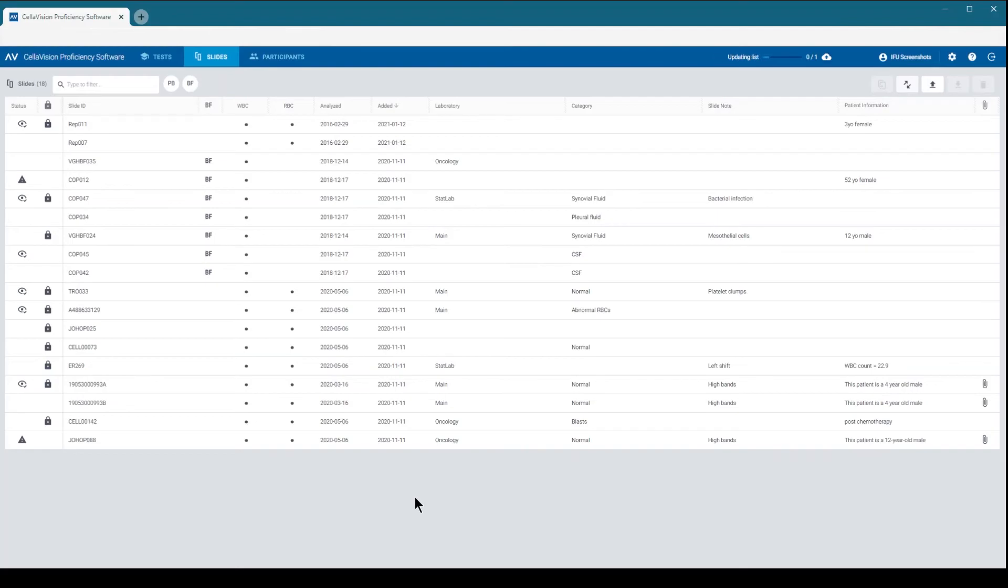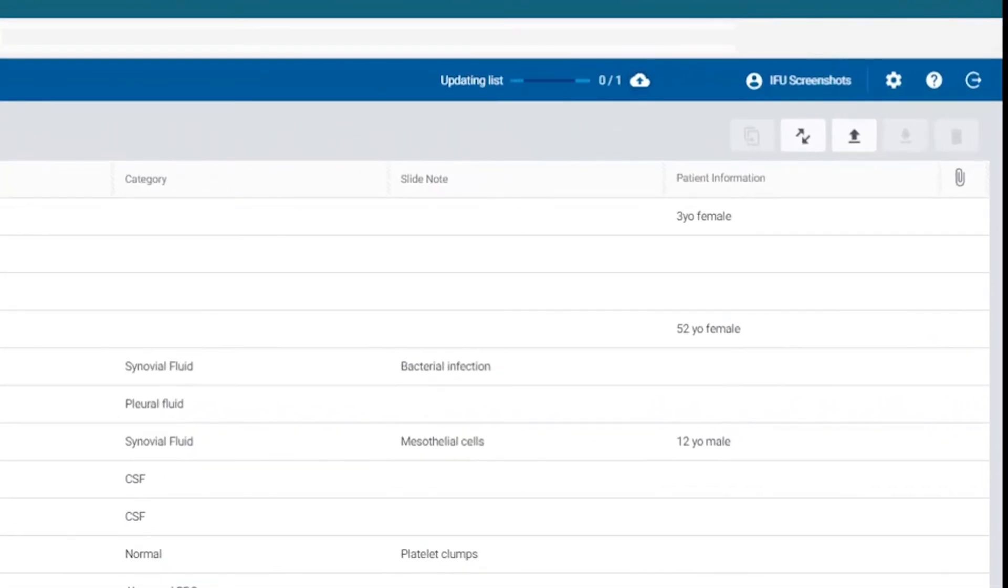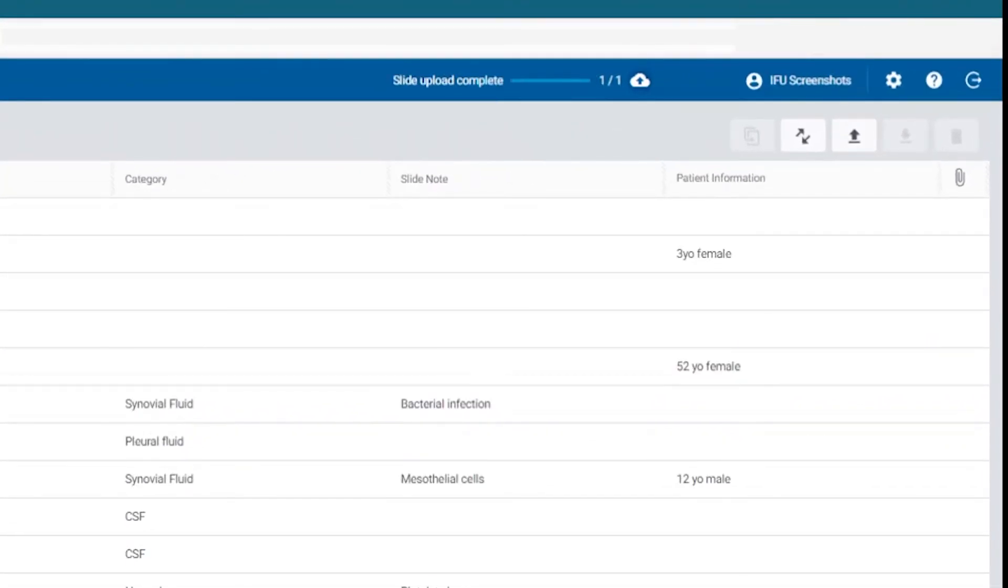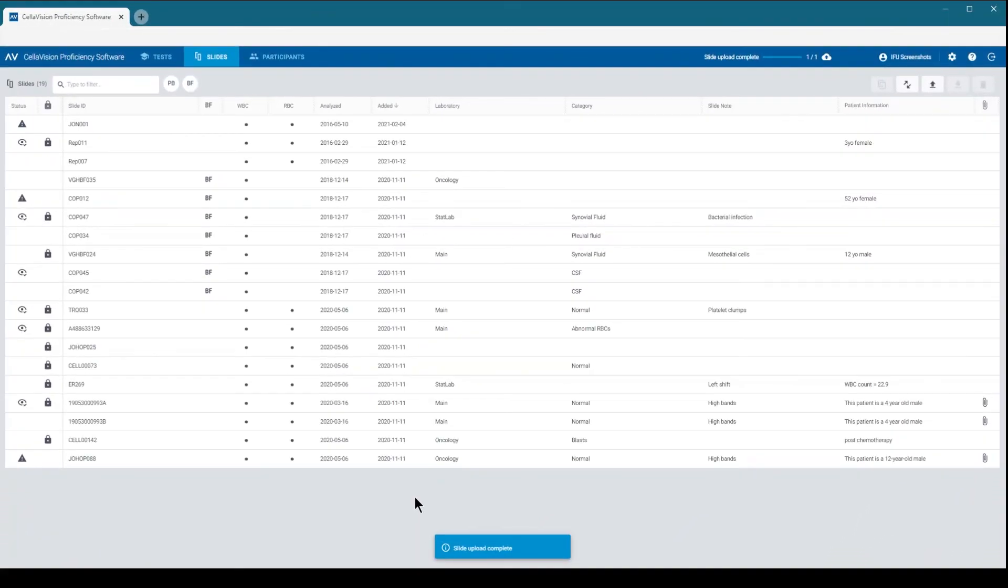You will see the slide upload starting. Depending on the number of slides you selected for uploading, this may take a few minutes. Note that patient information is not transferred with the slides.